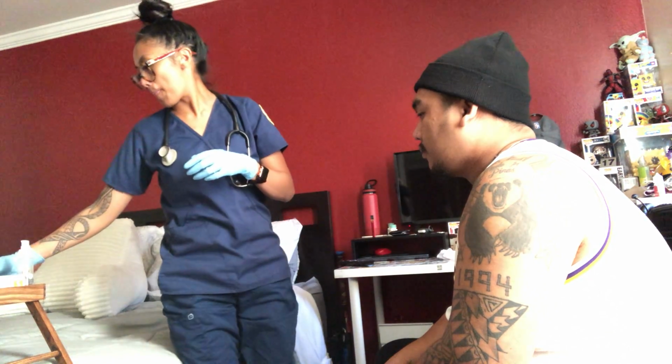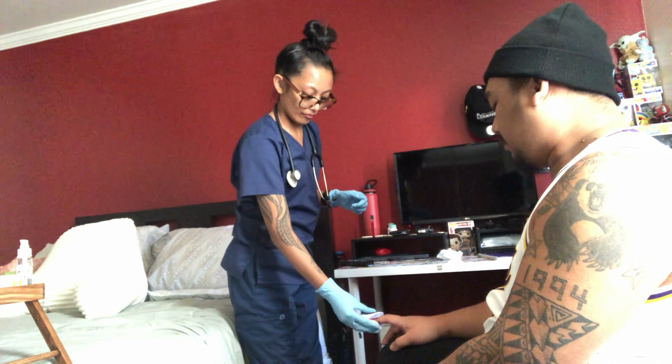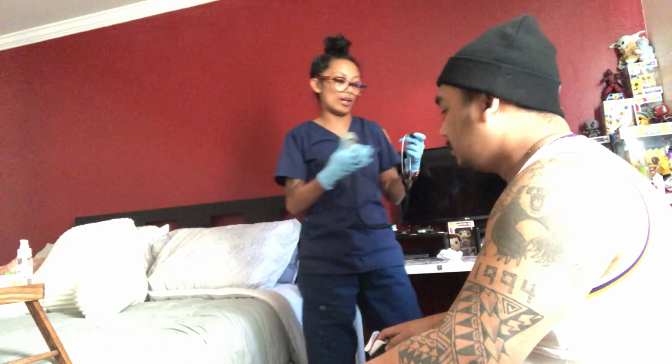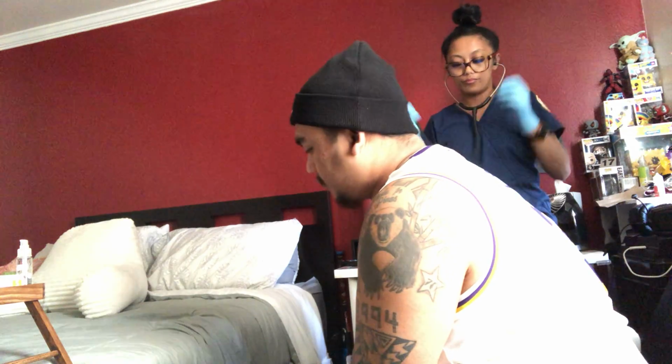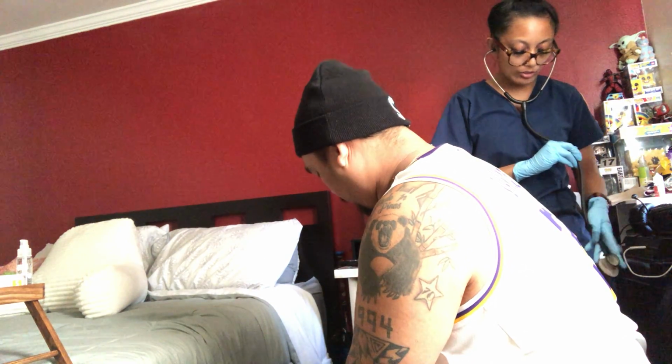Okay, so I took your vitals prior to this. I'm going to take your vitals again just to see if there's any difference in how you're feeling, okay? I'm going to listen to your chest again. I'm going to start in the back. Just relax and breathe normally, okay? I would normally go under the clothes, but I'm just going to go on top of your clothes.